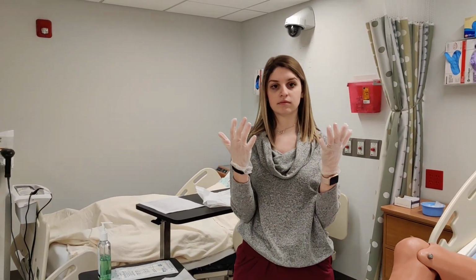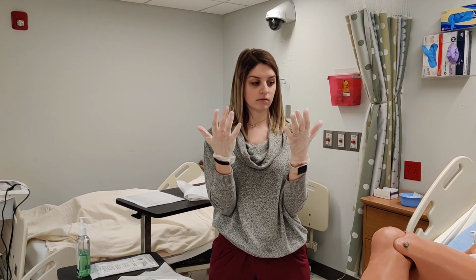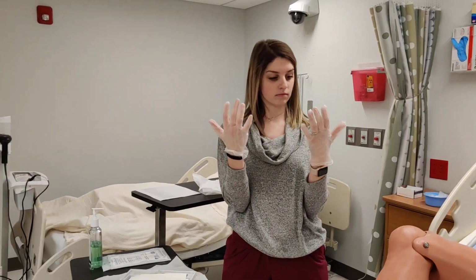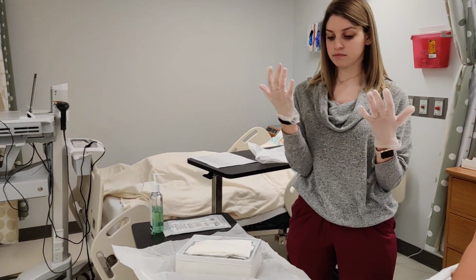For your purposes, make sure that your sleeves are rolled up all the way. That will help to prevent any future contaminations. Gabby is sterile, so we're going to continue with the skill.